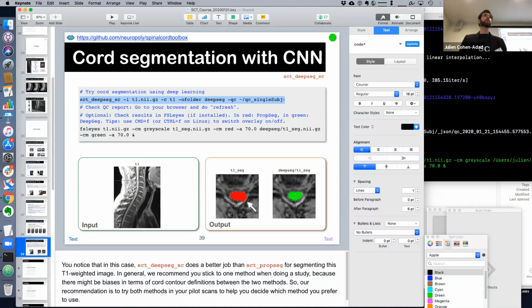If we know that a certain case is a little bit different from the database, you would maybe recommend PropSeg. It's impossible to tell, because there are more than 2,000 subjects with different parameters, centers, morphologies, ethnicities, sizes, ages, positioning, coils, scanners, and vendors.